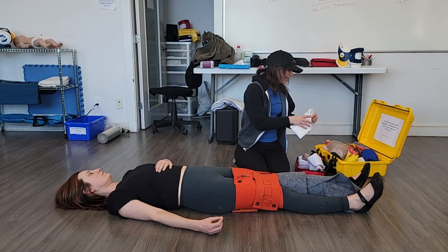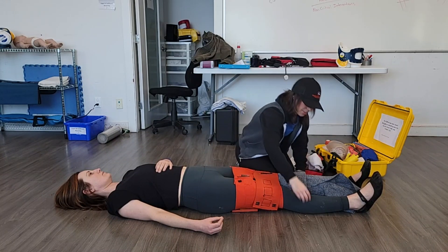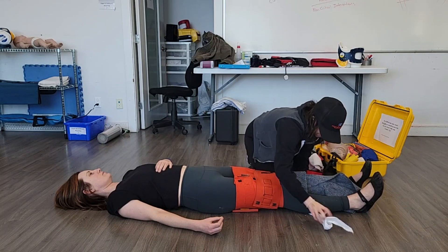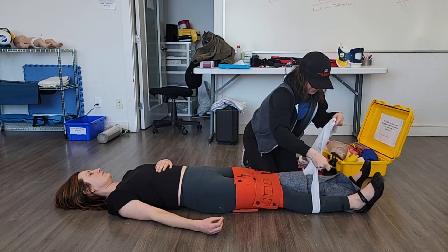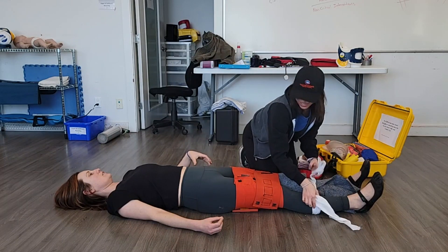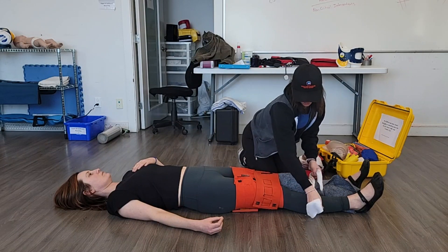Then one at the bottom — I was actually going to use a triangular bandage for that. Once you have these on, your partner can let go. But all three straps have to be on first.